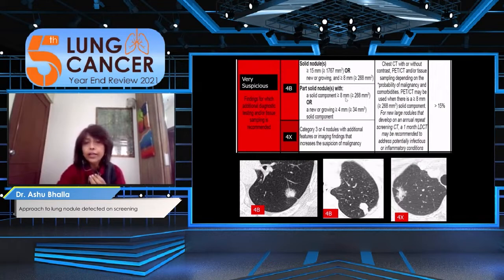Herein it means basically any solid nodule more than 15 mm or solid component more than 8 mm is going to require further evaluation, and most nodules which are this large, unless they show the clearly benign features mentioned in Lung-RADS 1, will require sampling.